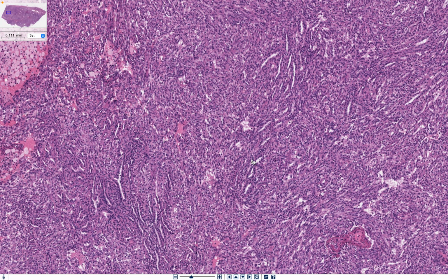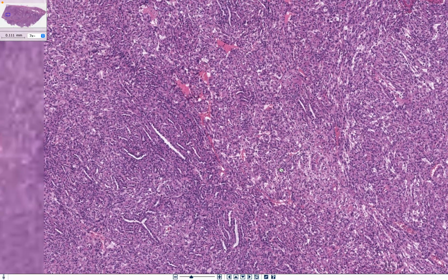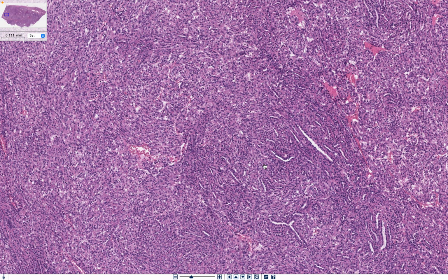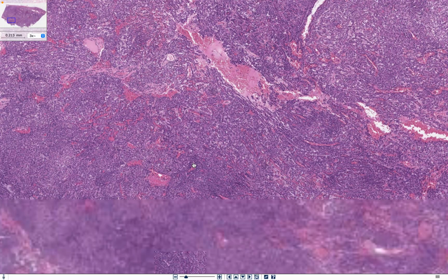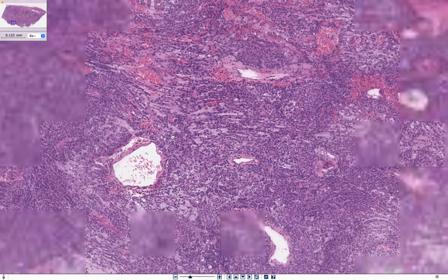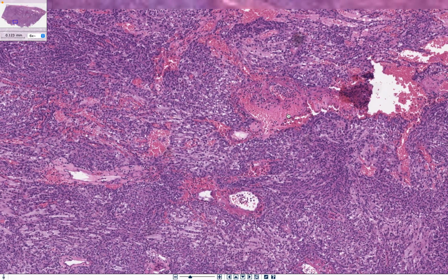Here in the tubular formation, most importantly, we have low-grade atypia or no atypia at all: bland cells, foamy histiocytes, bland tubular formation, and spindle cells, and also a very important feature, the mucin or myxoid stroma. So this is mucinous tubular and spindle cell carcinoma of the kidney. Here you can see the myxoid or mucinous stroma. Here is the mucinous or myxoid stroma in the periphery of the lesion.